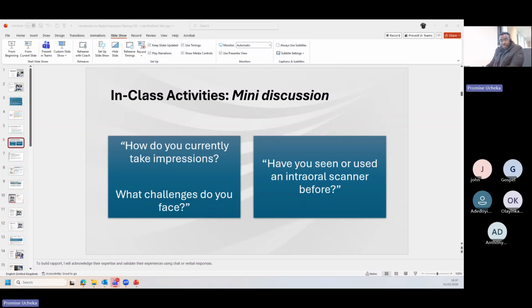Anthony, you wanted to say something before? Yes, like you have explained, we still use Alginate to take impression, then pour stone or POP to get the cast of the impression out. Thank you, sir. Okay, thank you so much.